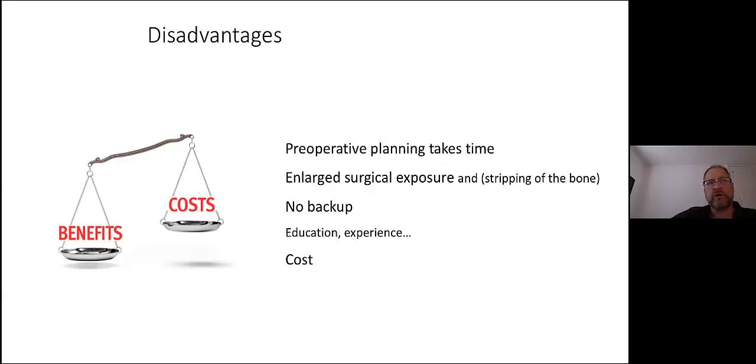We have a couple of plates. But now, since the surgery was planned for this exact plate, we couldn't go ahead. We had to send the patients home and get those plates, which were quite unusual. It was an unusual case. So you get kind of locked to the planning. You have to be aware of that.